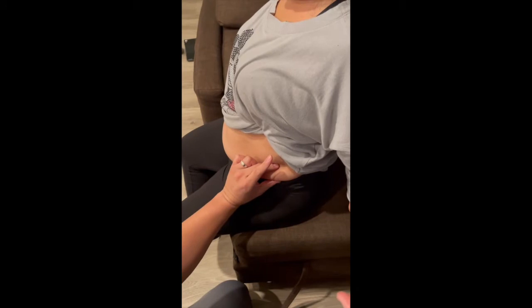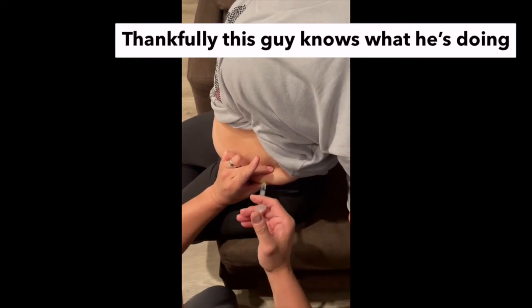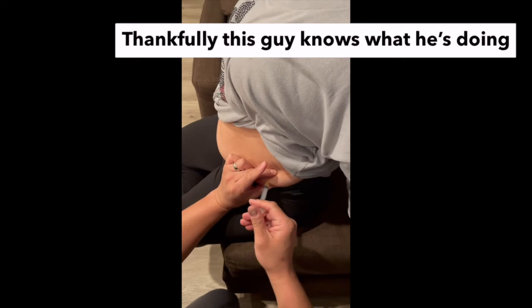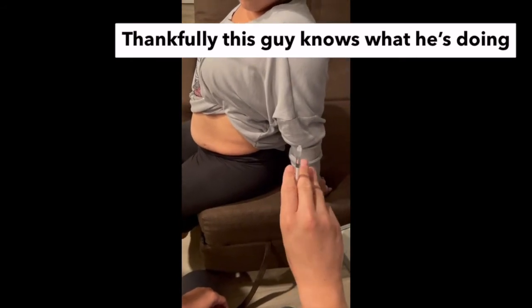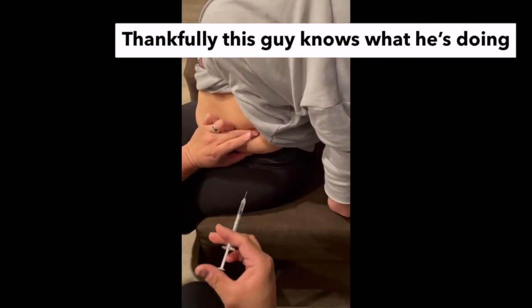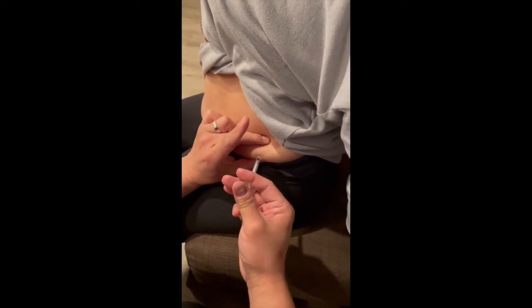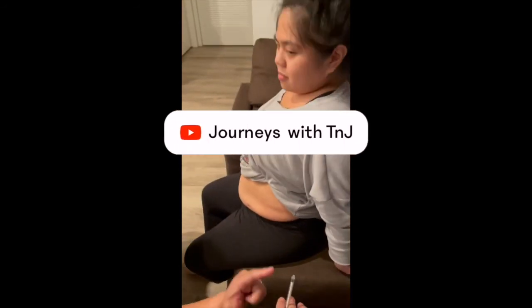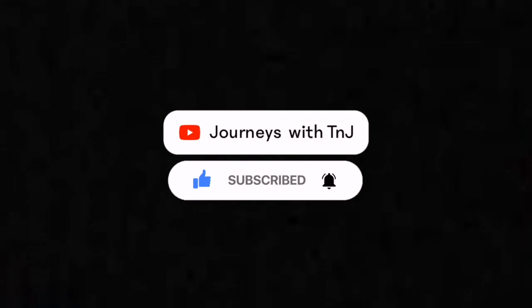Ready? One. Don't push it in too hard — the medicine. Ready? One. Don't push the medicine in too fast. That burns! That freaking burns! Don't worry — all the medicine burns! Okay, there you go. Where's the cover for this? Like this, to make sure there's all the med down here. Tap it so it comes down, then go up like this — have a little squirt at the top. Same thing here. And then I usually just count and then squeeze real hard. Ready? One, two. This one is thicker — a lot thicker than this needle. Your skin was resisting.